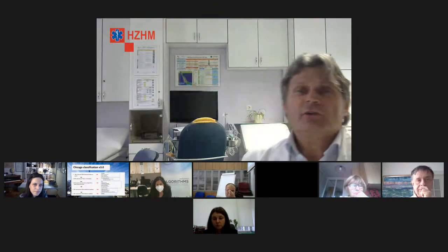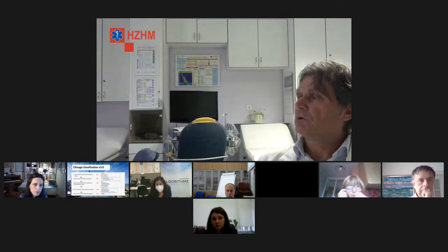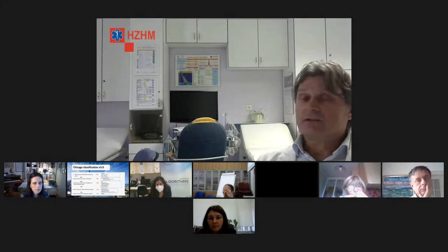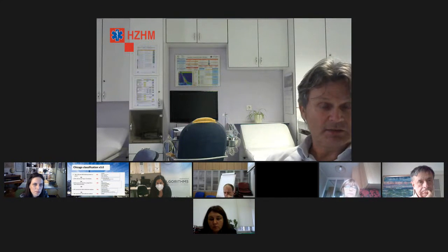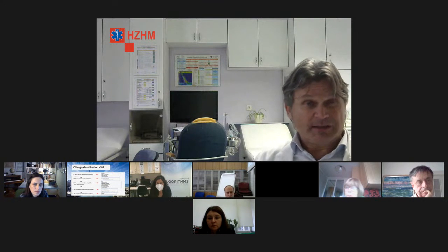Kad sam kod solid state katetera, ljude iz MMS-a sam pitao izravno i rečeno je da koštaju 10.000 eura. Pitanje je za sve nas: kako kod nas može koštati takav kateter 220.000 kuna, ako je 10.000 eura, ako me konvertiranje ne vara, oko 70.000 kuna. Stresao sam se kad sam vidio, to je 3 puta skuplje.